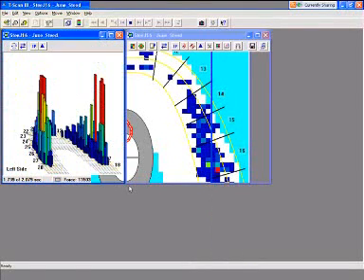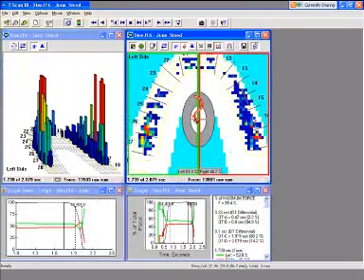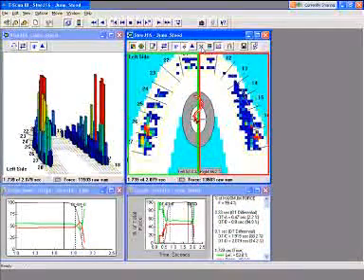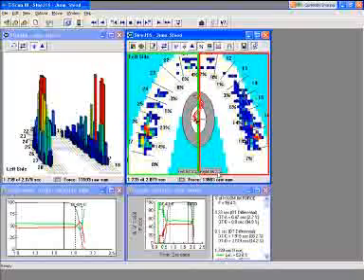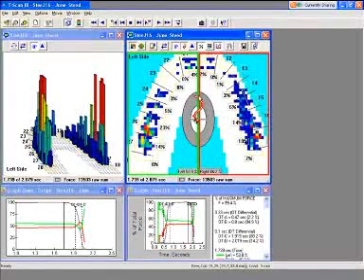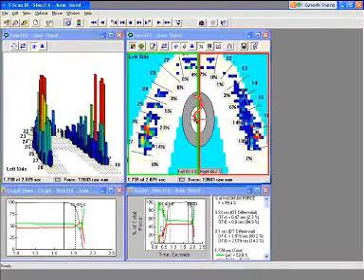That was it. So if that's all I did, there's some valuable information here for the doctor and for you, the dental hygienist. I'm going to turn the percentages on, and you can see very clearly that if I'm dividing my mouth in half, 53% of the force is on the left, 46 is on the right, and this little trajectory is that little tail that I talked about. Now, in this case, I start here and go all the way over here to center. So really, I'm pretty balanced in the end because this is a little football field here, as I say to the patients, which our goal is we want to end up in there.